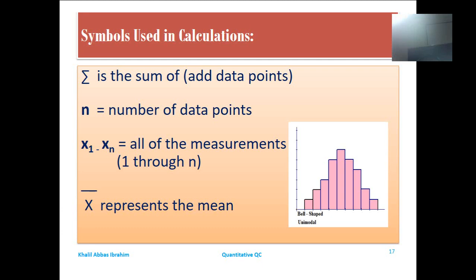And also we pointed out the importance of adopting, implementing and utilizing the tools which had been set specifically for that issue. We went through some mathematical and statistical procedures which are indispensable for setting the programs and implementing that program concerning the quality control of quantitative laboratory services.